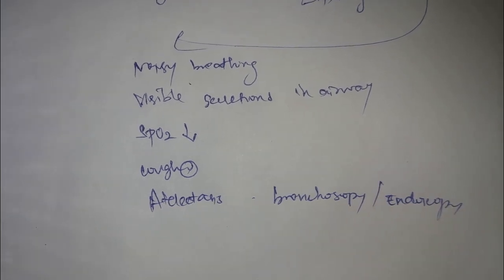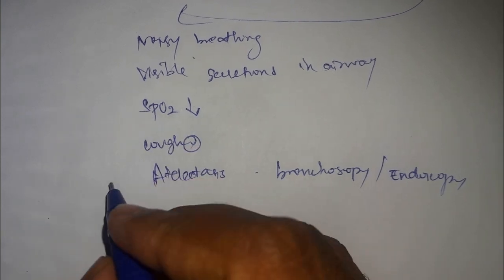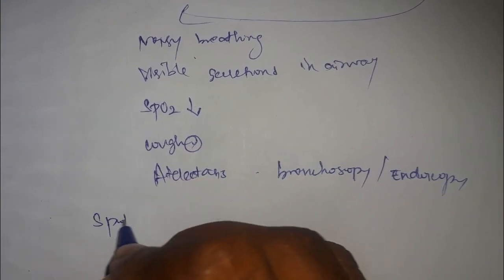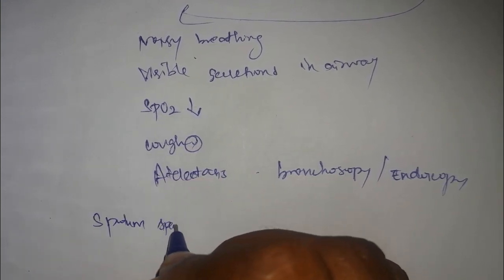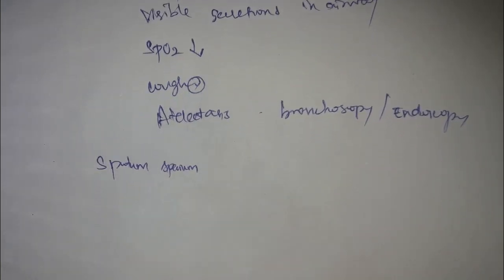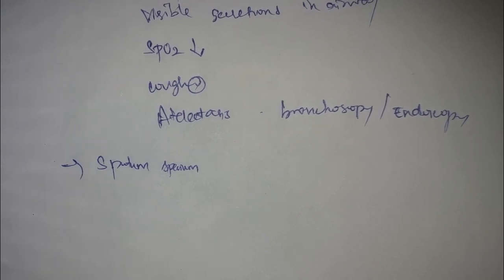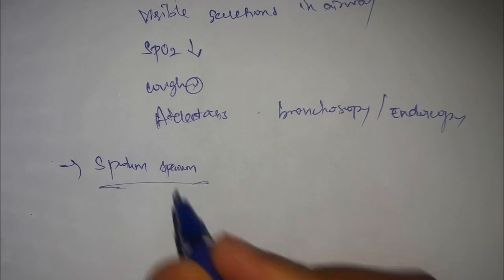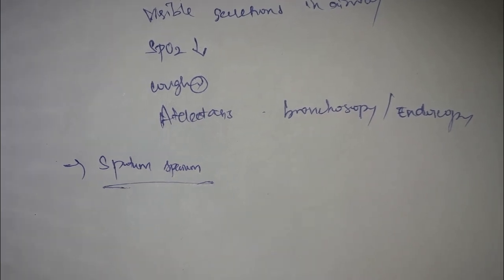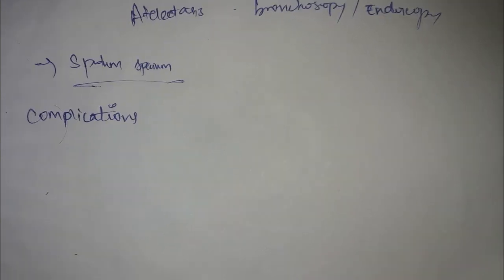Then coming to diagnostic. When we take a sputum specimen for investigation, we can use it. If the person is bedridden, can't breathe deeply and can't produce a cough, but we need their sputum, then we can do the suctioning. That is, a sputum specimen is obtained by this procedure.